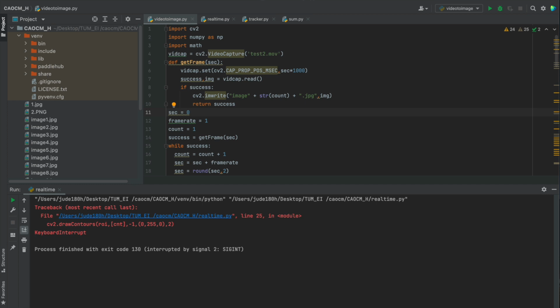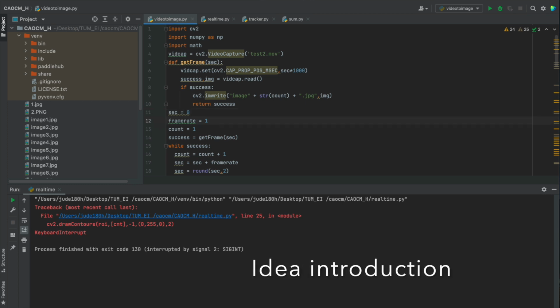Our idea is to take a video as an input and have real-time feedback on whether the current pose is good enough. Our core function uses the thoracic COBB angle as a criterion to estimate whether the test subject has scoliosis or not. The current version of calculating the angle is to draw a contour of the posture and to use the mouse to take the position of 4 points from the back and calculate the angle from these 4 points. A real-time estimation is not available in the current phase.